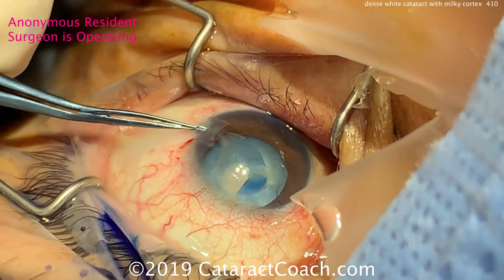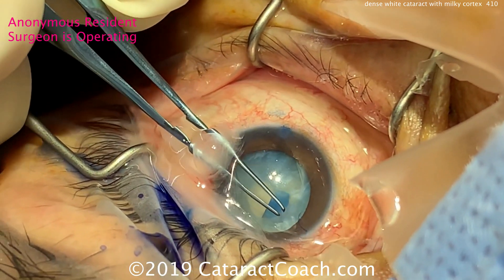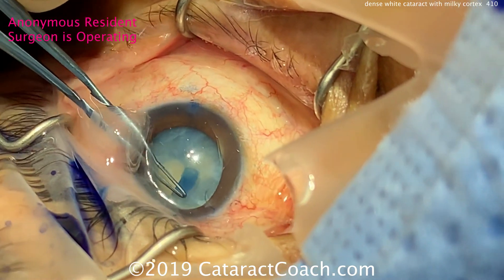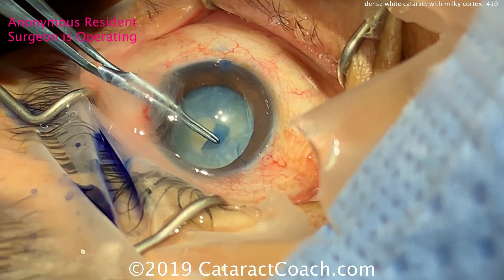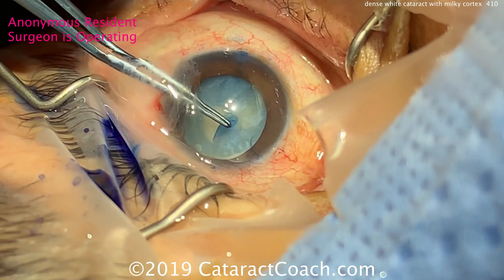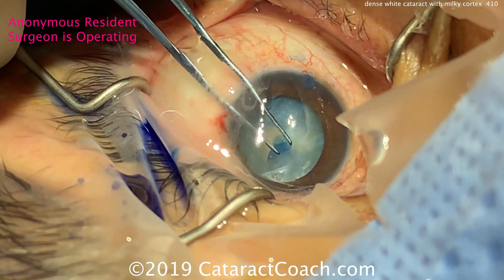The rhexis has started, and the resident is going to try to finish it. What are the other options here? He's already committed — he's not doing the double rhexis technique. At this point, you can actually go into the capsular bag with the forceps and try to rock the nucleus gently to get more of the fluid out.